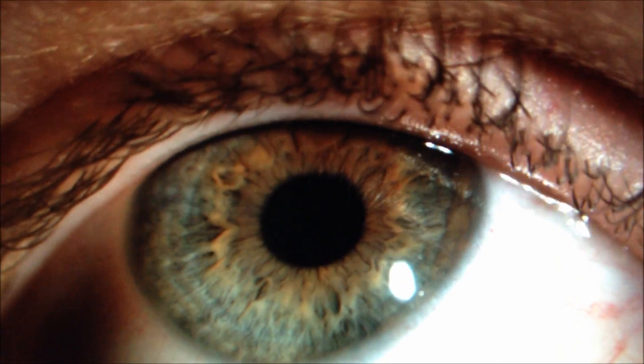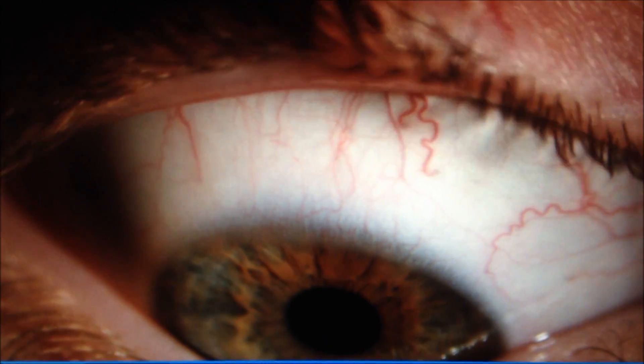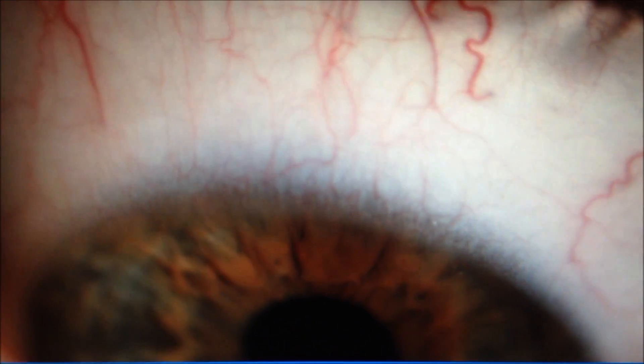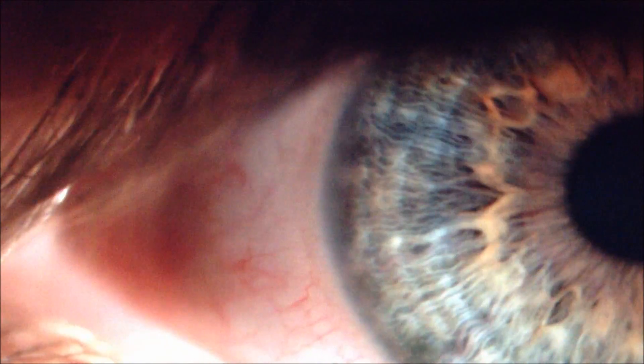Now we'll get the patient just to look down, and then we'll bring the upper lid up out of the way just so we have a better look. If we increase the mag here, we'll really have a better look just at the limbal vascularization and the limbal redness. There's a slight bit there, but that's just because normally the lids will cover this part of the cornea during the day-to-day. We'll have a look at the other side here — just mark the limbal redness and the limbal vascularization. We'll swap over to the other side and just note it.